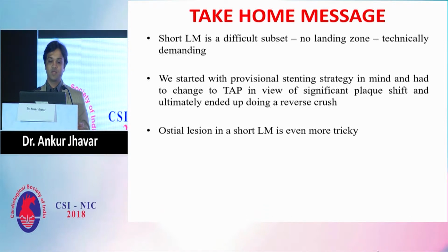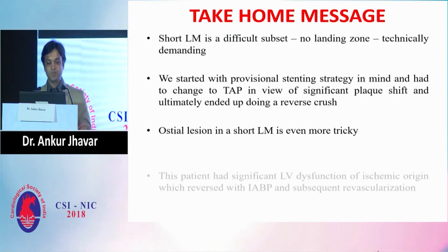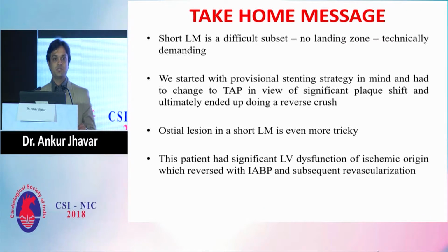Also, ostial left main lesion in a short left main is even more tricky. This patient had significant ischemic LV dysfunction, which was reversed on revascularization, and of course the IABP support, which was taken off later.